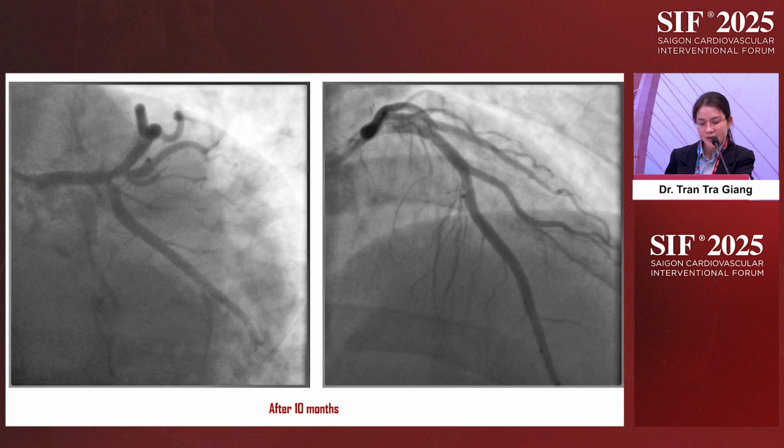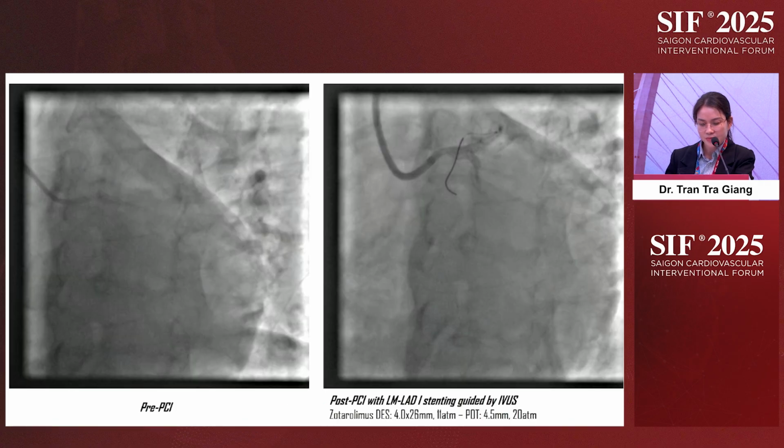After that, I have a funny story about the patient. After PCI, it was the first time you will see after stenting. The patient had stenting from left main to LAD, with a provisional stent, and checked by IVUS, it was quite good.